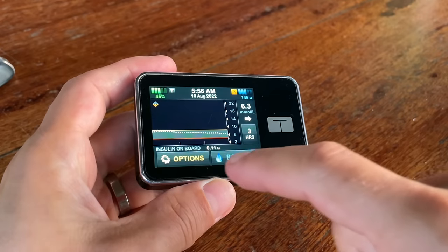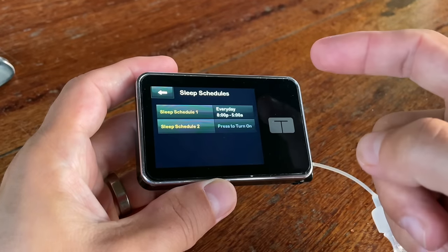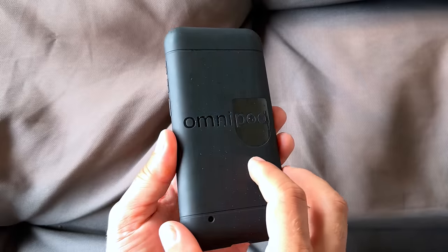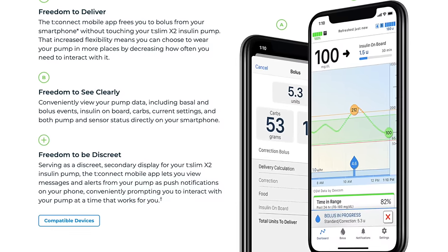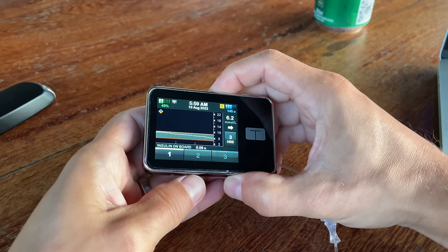A massive difference between these two pumps is how you control them. The T-Slim X2 has a colored touchscreen you use to give insulin, change settings, and do everything else. The Omnipod 5 has no touchscreen and no buttons — it's fully controlled from your smartphone or a controller included in the starter kit. T-Slim X2 cannot be fully controlled from a smartphone; Tandem's T-Connect app can only view data, and in the US you can give a bolus via the app but cannot fully control the pump. One thing I love about the T-Slim is that it's almost impossible to forget — you're hooked to it all the time. Anytime I want to check my blood sugar I just reach into my pocket and press the wake button.